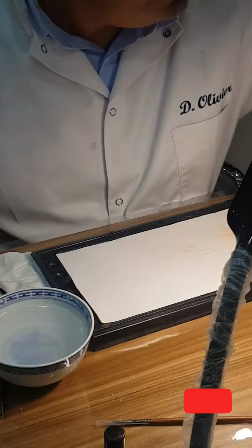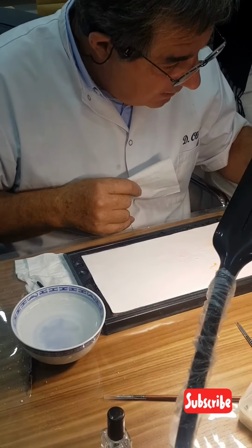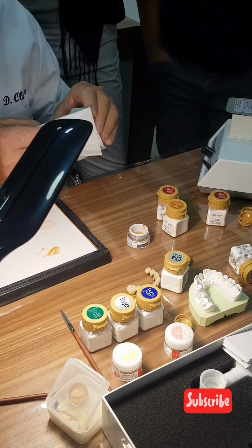Where are the tissues? Thank you very much. I have to condense now. Look, the water. Two times.